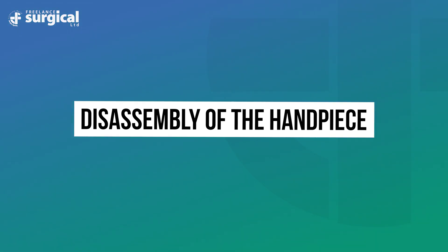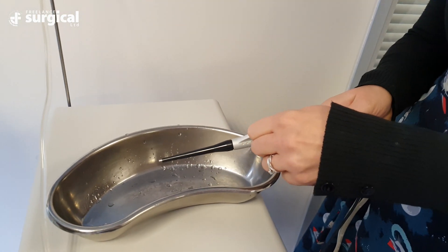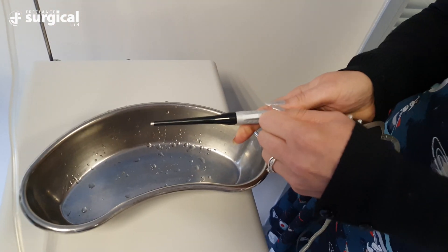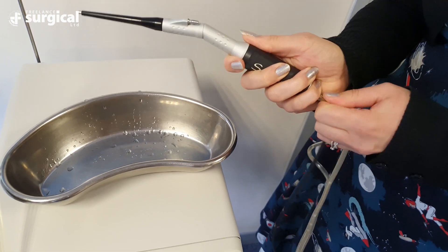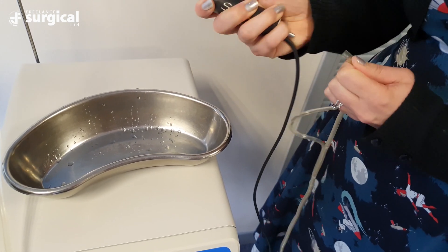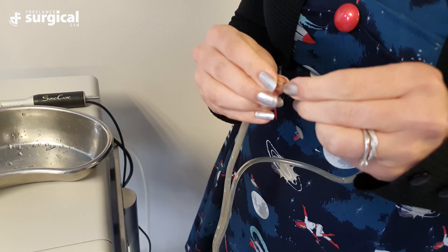The tubing will stretch over the tip. Using the standard wrench, hold the handpiece in your non-dominant hand and attach the wrench to the bottom of the tip and turn anti-clockwise to undo. Disconnect the handpiece tubing from the back of the handpiece and at the fluid connector and join the two tubes together. Push the wider lumen into the narrow lumen to lock the two together to complete a circuit.